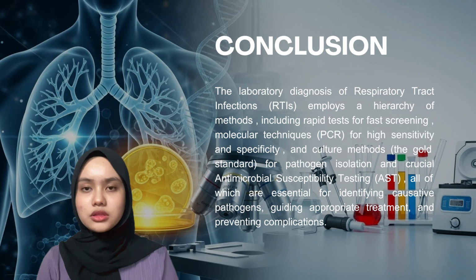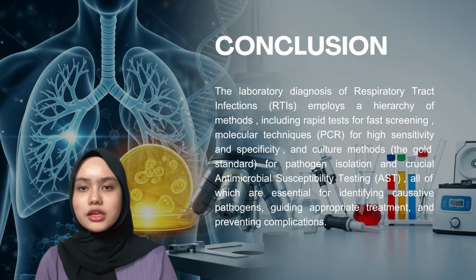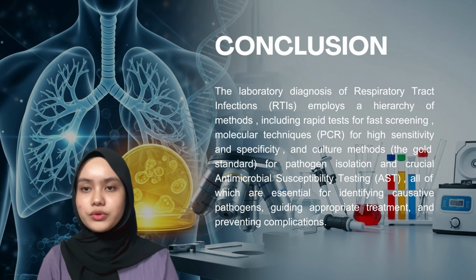Tests for respiratory tract infection use quick tests, PCR and culture to find the germs causing infection. These methods help doctors choose the right treatment and prevent the illness from getting worse.